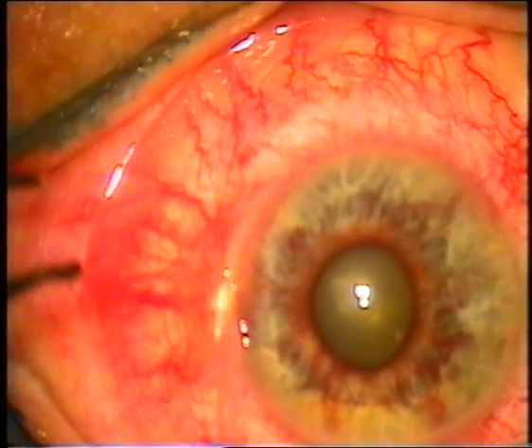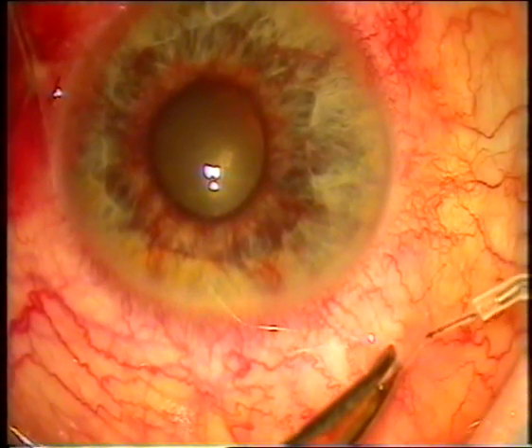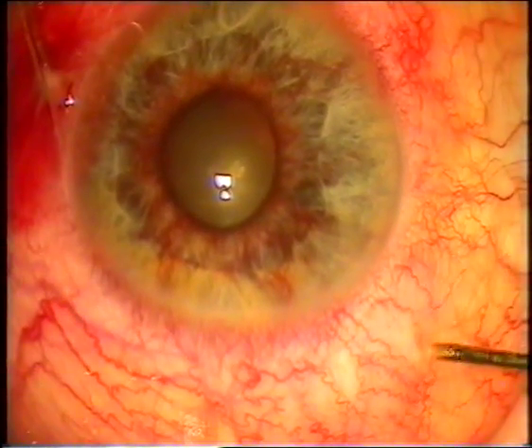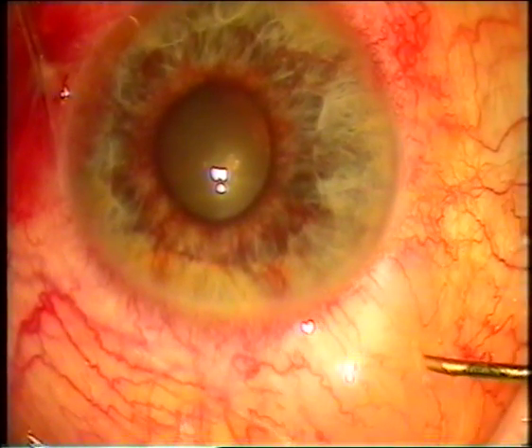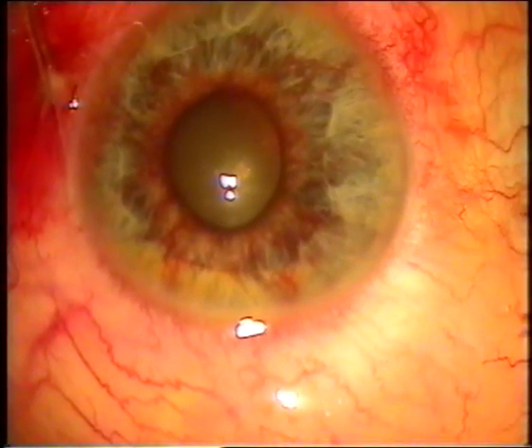Hemorrhage during operation and in the postoperative period would lead to unsuccessful glaucoma surgery. So our plan was to perform Professor Sinksy's transconjunctival transciliary filtration. The steps of this operation are as follows: we make a hole in the conjunctiva with the help of a 100-micron fugo blade tip.